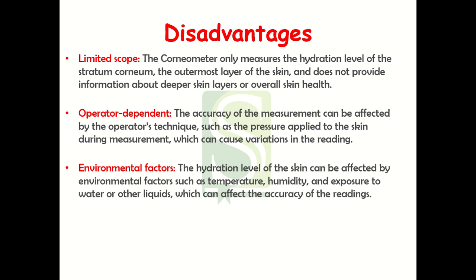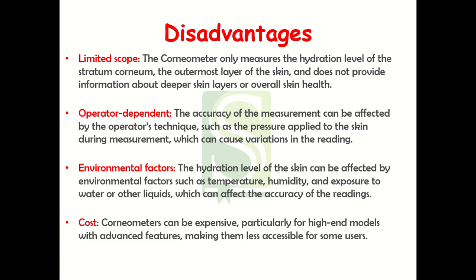Next, environmental factors. The hydration level of the skin gets affected by temperature, humidity, and exposure to water and other liquids, and hence this can give you erroneous results. Next is cost. Even though the equipment is very compact and small, the principle and technique on which it is based make it costly. These are expensive, especially the high-end models with advanced features, and this makes it less accessible for some users.